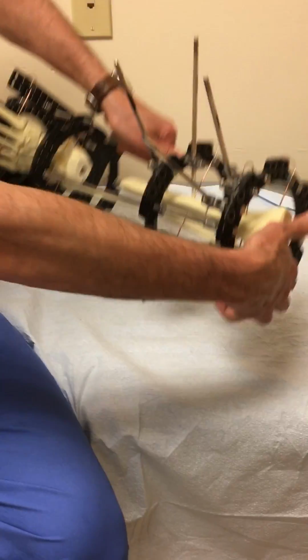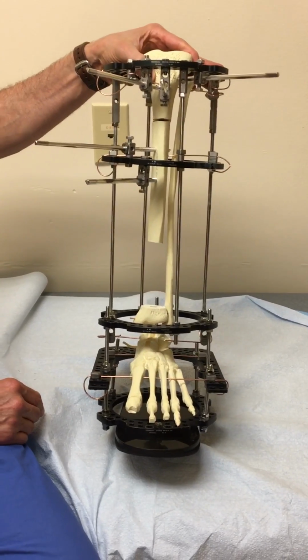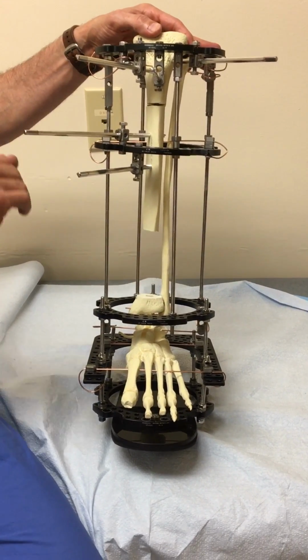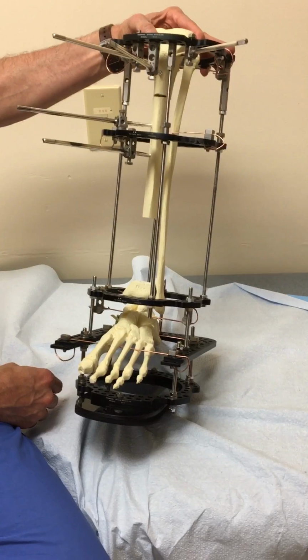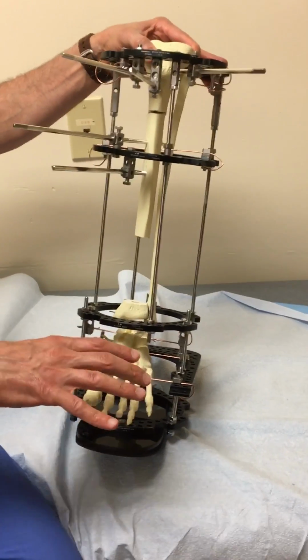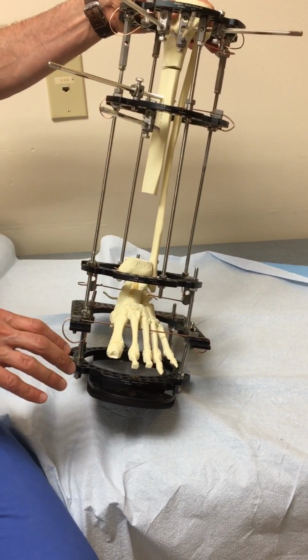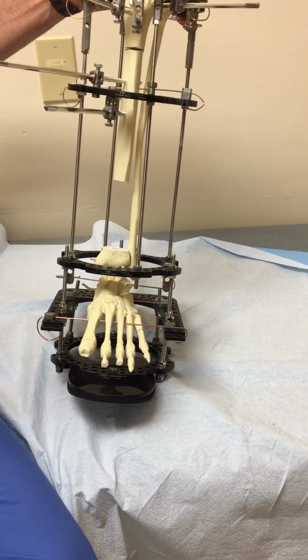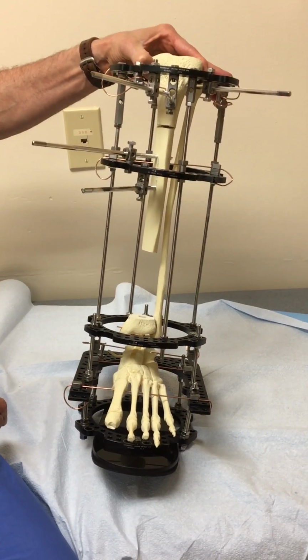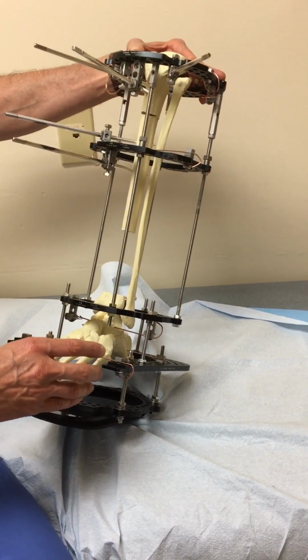Okay. Now you'll notice when we put this on the sawbones, it may be a little bit high for your patient. You know, I'd recommend putting this first wire just below his growth plate and then build the frame, okay? And it's like the sawbones that we made. Now, these 4 long threaded rods should all remain in place, and you'll just slide this construct with these 3 rings in the foot plate around the leg if you can, okay? And then, like we did in the lab, you'll first put your transverse wire in the proximal tibia just below the growth plate, okay? And that'll set the balance, right? You got to make sure that that frame is then balanced all the way down onto the foot.